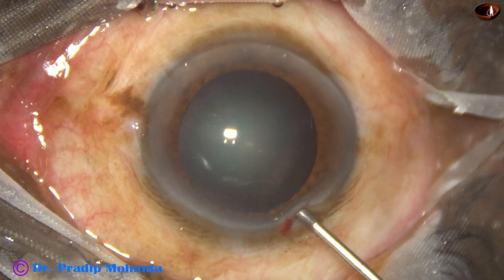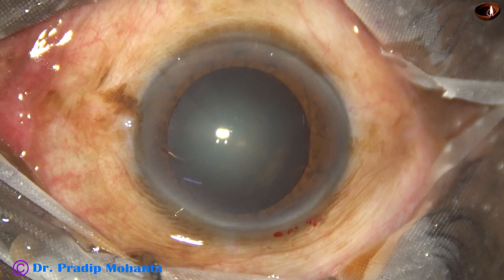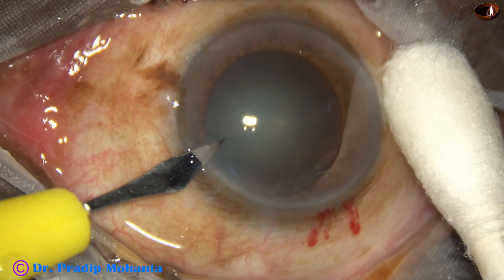The anterior chamber is filled up with 2% hydroxypropyl methyl cellulose. A side port is made on the left side of the main incision.